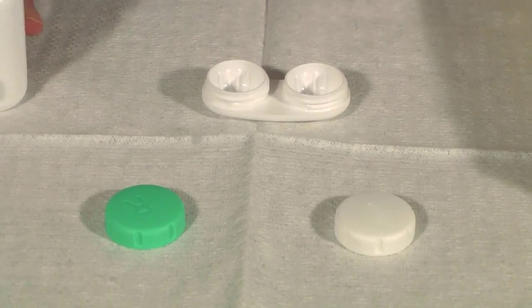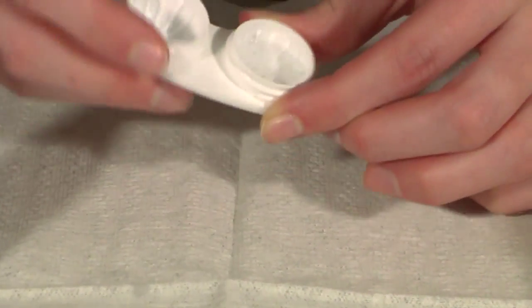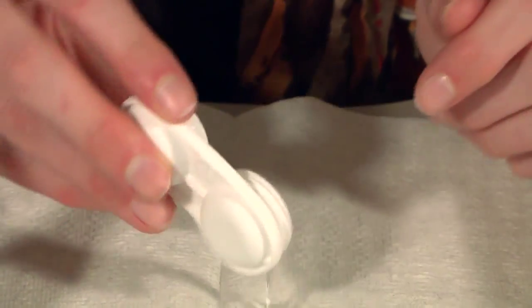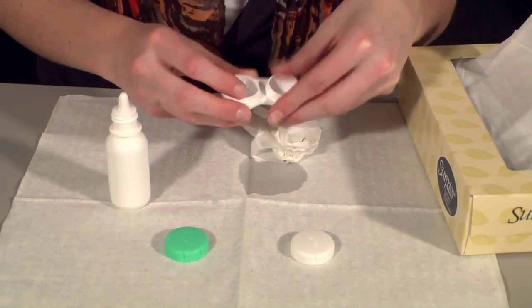The case itself can be a source of bacteria, so it needs to be cared for as well. After removing your scleral lenses from the case, rinse the case with your conditioning solution. Wipe the case with a clean, dry tissue and store it upside down with the caps off.